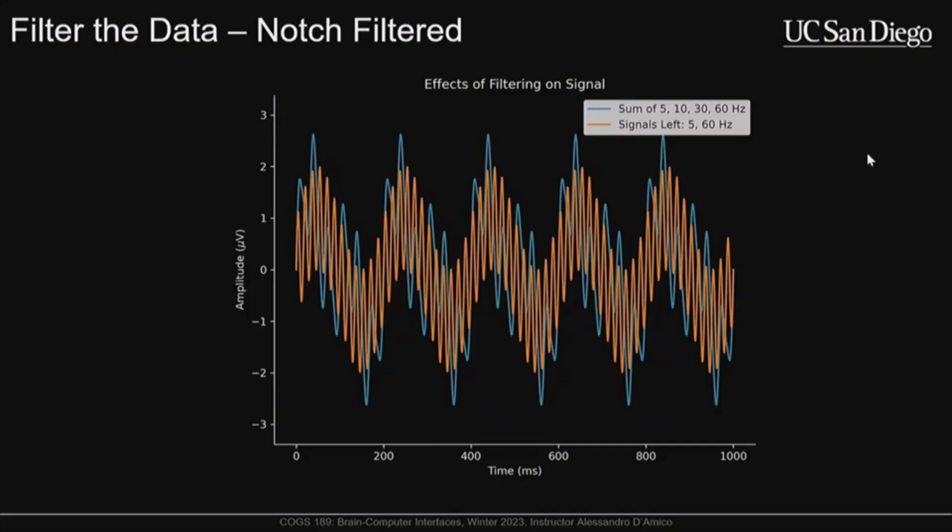And if anybody has any music production background, the filters are exactly the same. So if you've applied a low-pass filter to your audio track, you'll hear that it becomes a lot darker, a lot more muffled. And if you apply a high-pass filter, you only hear the hi-hats and maybe the harmonics of your instruments and stuff. The exact same concepts are true with this.